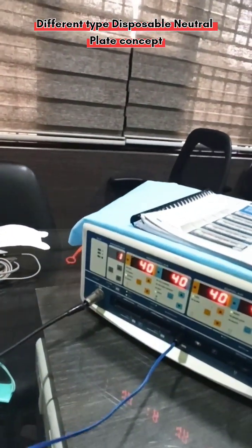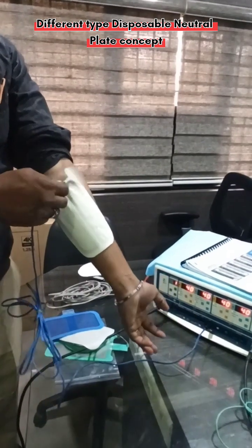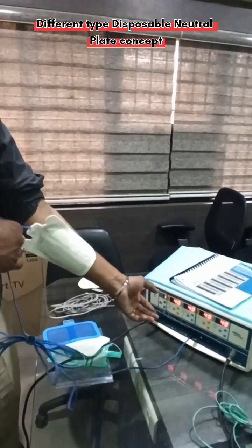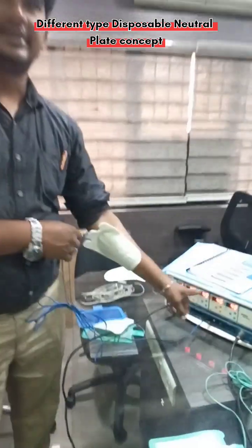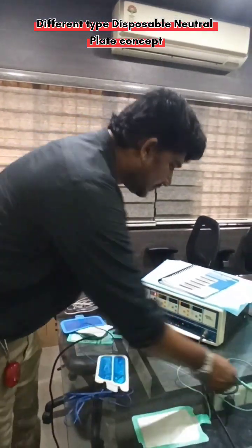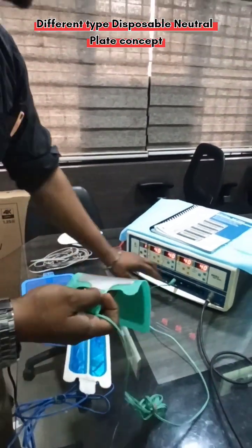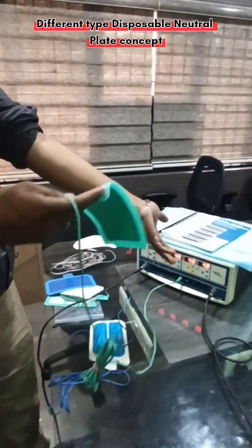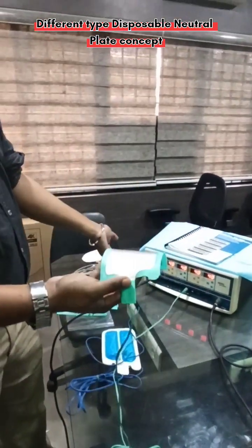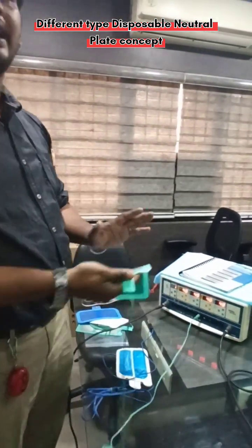This is the advantage of the split-type earth plate: even if the patient is not connected, or during surgery if the plate is not connected properly, the indication will automatically come — the neutral plate safety indication will appear. But with the normal single-section plate, once you place the connector inside the machine, the error automatically stops — even if the plate is not on the patient at all. So the single-section plate offers less safety, and the split-type offers more safety.